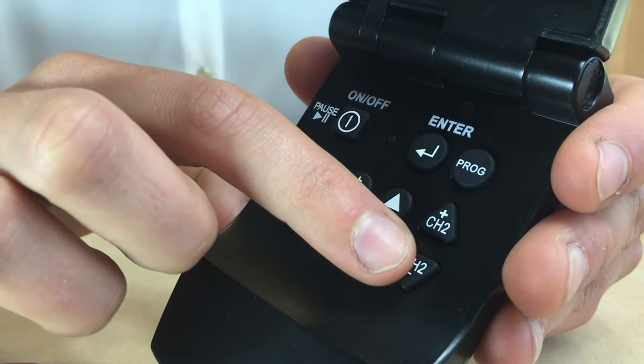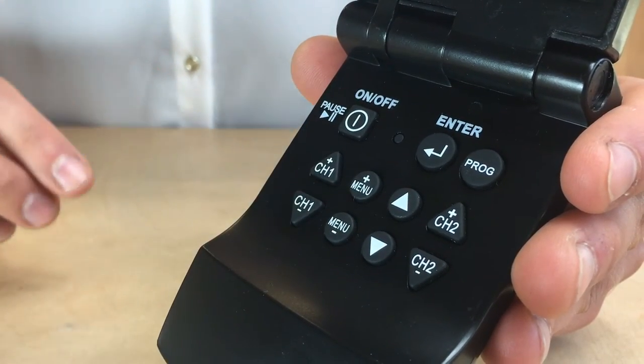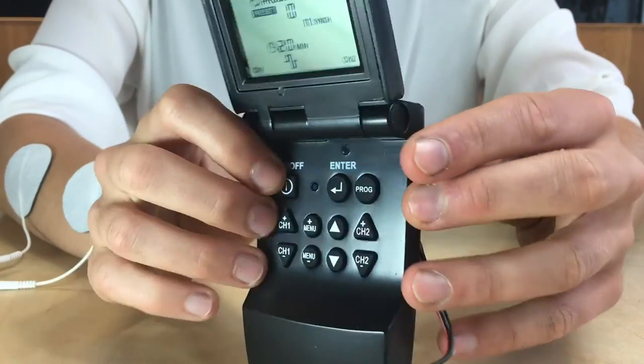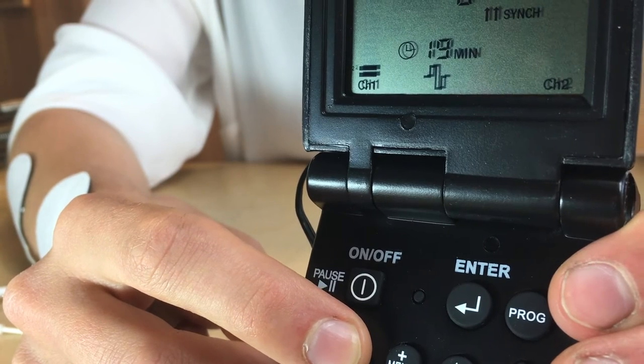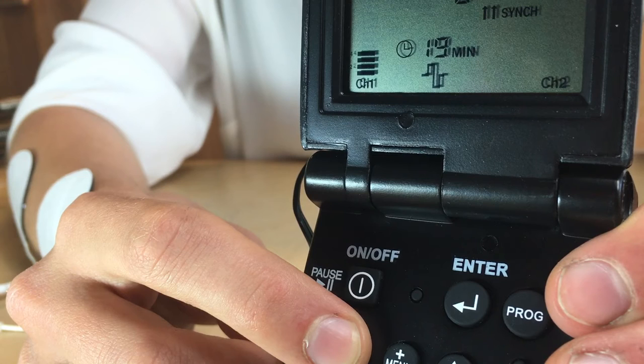The intensity can then be adjusted on the right or left side for either use in Channel 1 or Channel 2, which will control the electrodes connected to either channel. You can slowly increase the intensity to the point where you feel it is comfortable and you are feeling relief in that area. The intensity can be adjusted at any point during treatment depending on your sensitivity and tolerance.